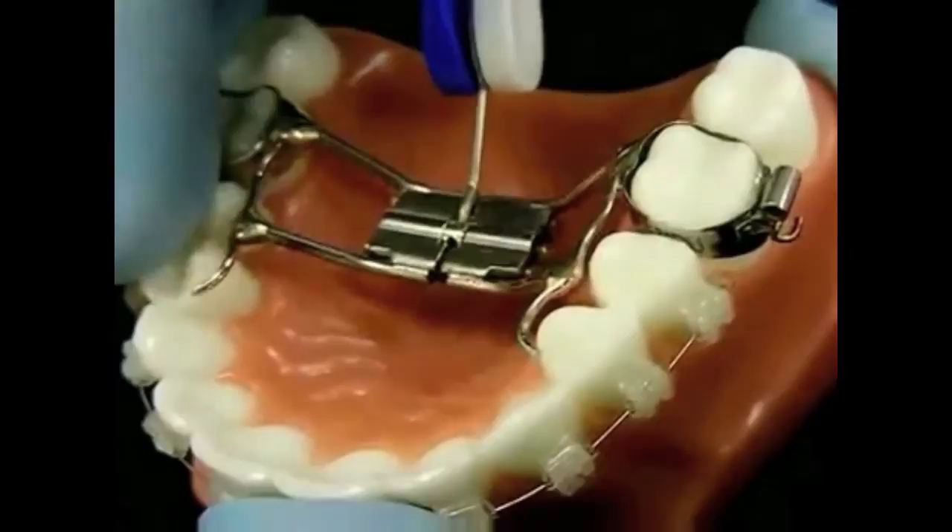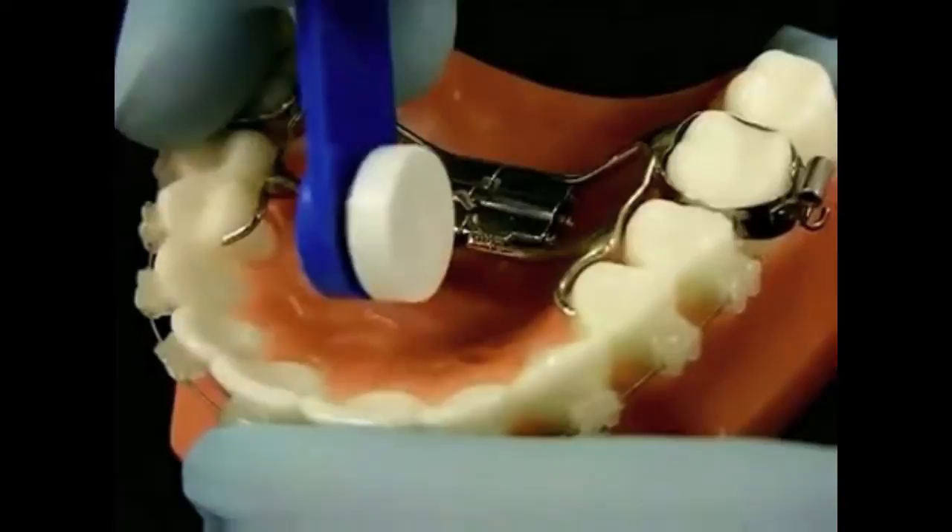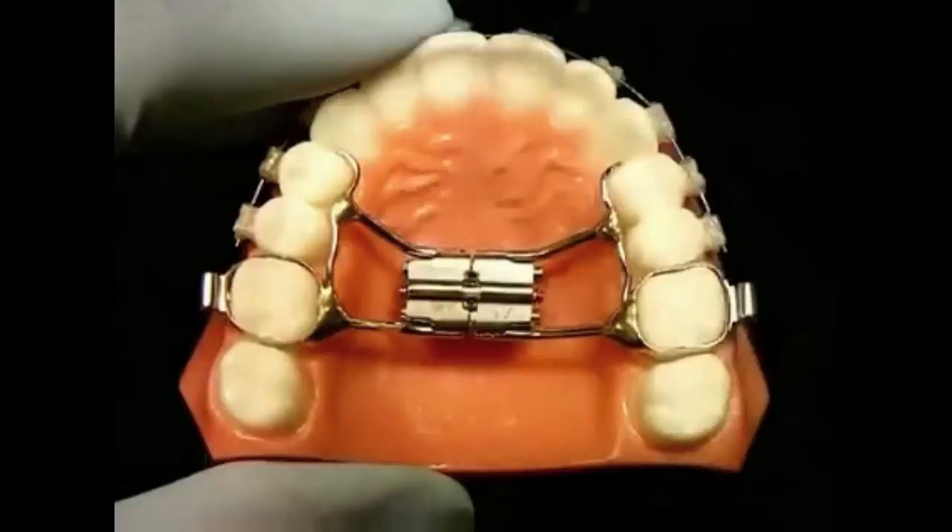The most common mistake in activating palatal expanders is on the removal of the key. Most people will correctly insert the key and correctly turn the screw by pushing the key towards the back of the mouth, but will then unwind the screw before removing the key. This action results in not activating the palatal expander at all.